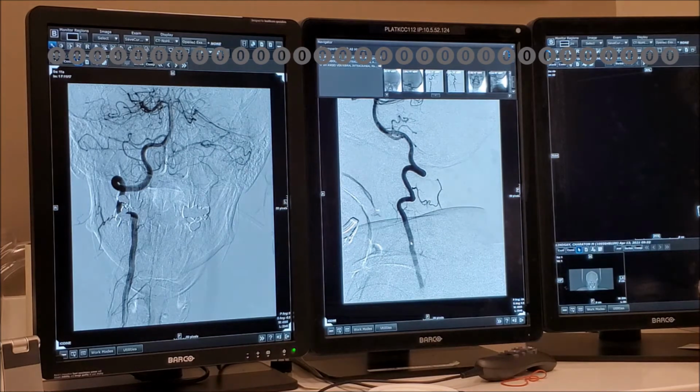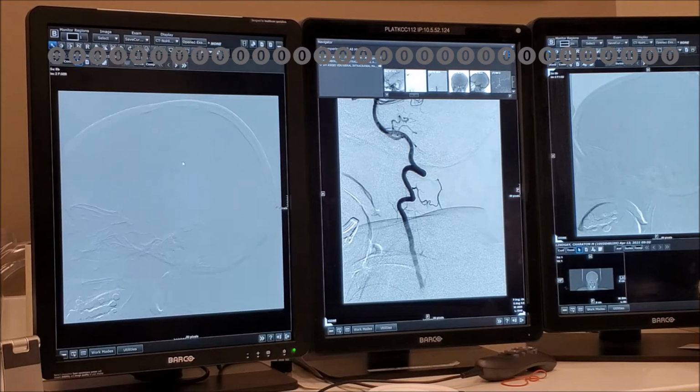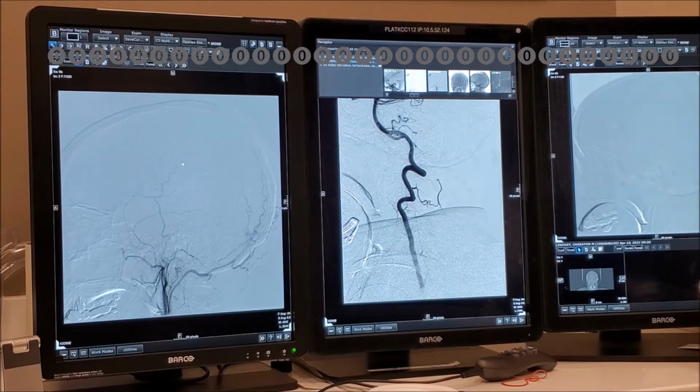Okay, Greg, can you see the odontoid process here? No, not well. Does anybody see the odontoid process here? Was it this one? You see the odontoid process? Remember we said this anastomosis here with the vert? Right here. Here it is.